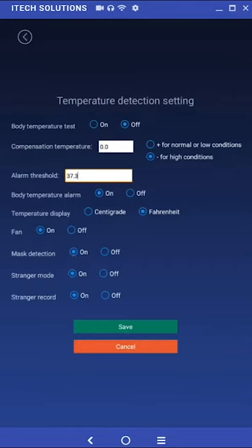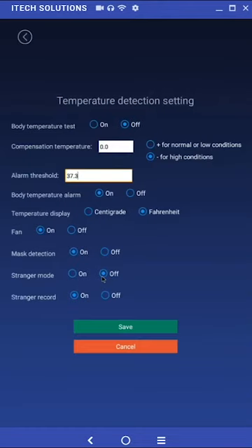Stranger mode and stranger record. Turning stranger mode to on will allow strangers to be granted access. Leaving this setting off will deny them access even when all other criteria for entry are met.